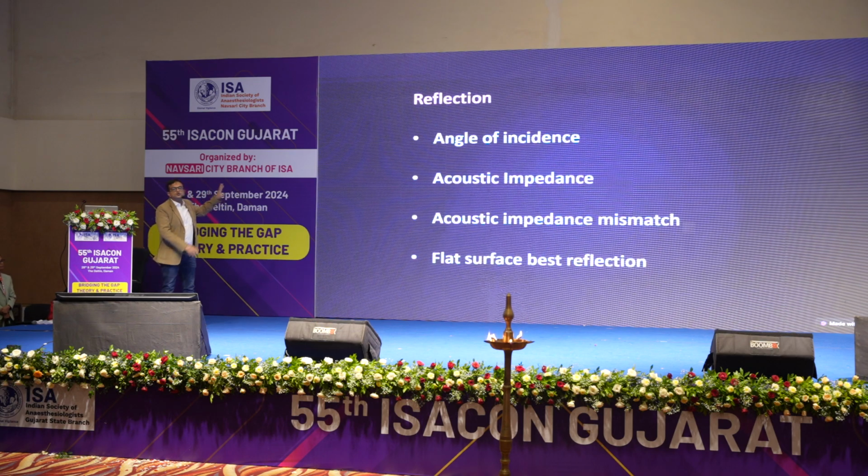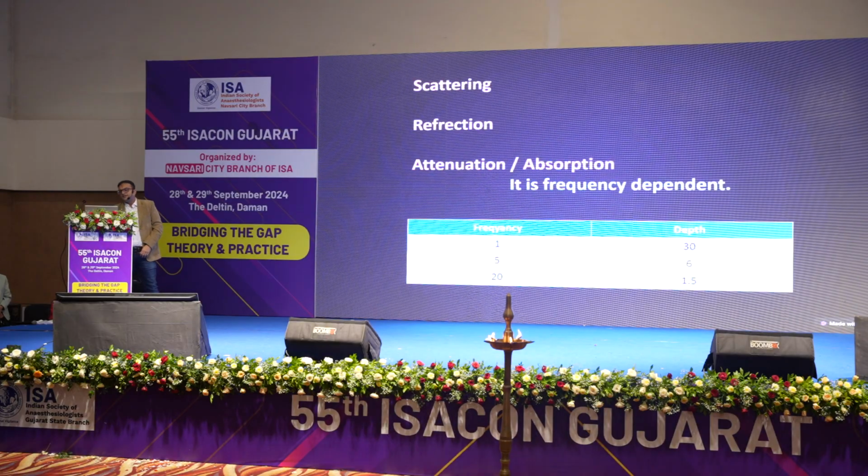So if two structures have a very wide acoustic impedance difference, like the pleura, which has a high acoustic impedance, but below it air has a very low acoustic impedance, that's why the pleura will look more hyper. Got my point? In the same way, the surrounding structure decides the acoustic impedance and it will generate the picture.